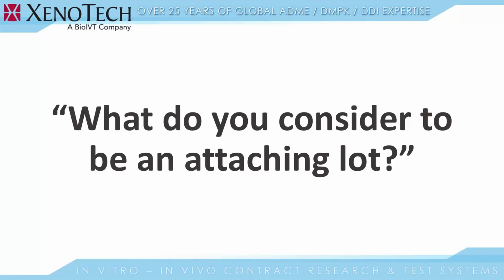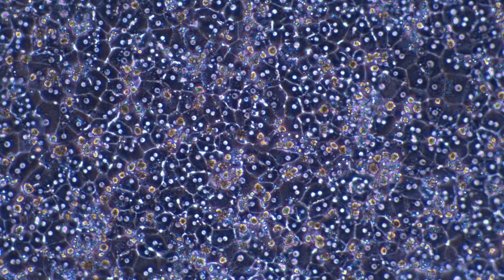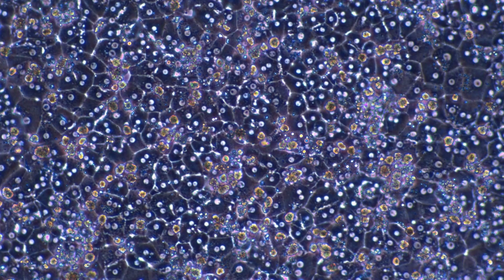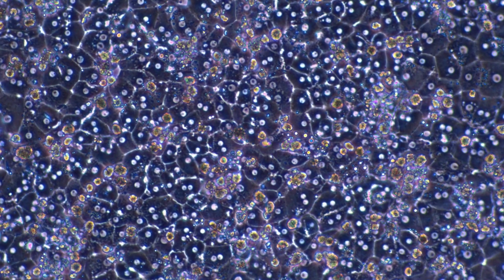All hepatocyte lots undergo rigorous testing to look for attachment characteristics. Once those characteristics are determined, we then further test to optimize for seeding density and to provide our clients with mRNA and enzymatic induction data. To be qualified as attaching, cells must form a monolayer that is at least 85% confluent and also last through a 3-day induction assay. These cultures generally will survive much longer in culture.